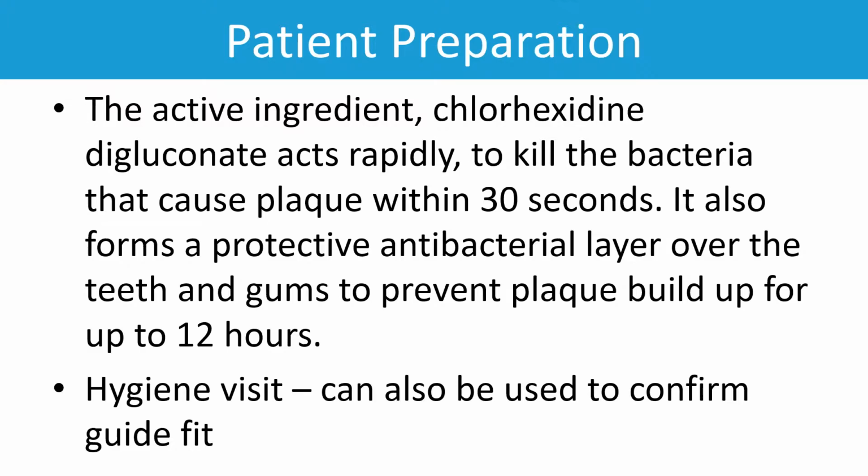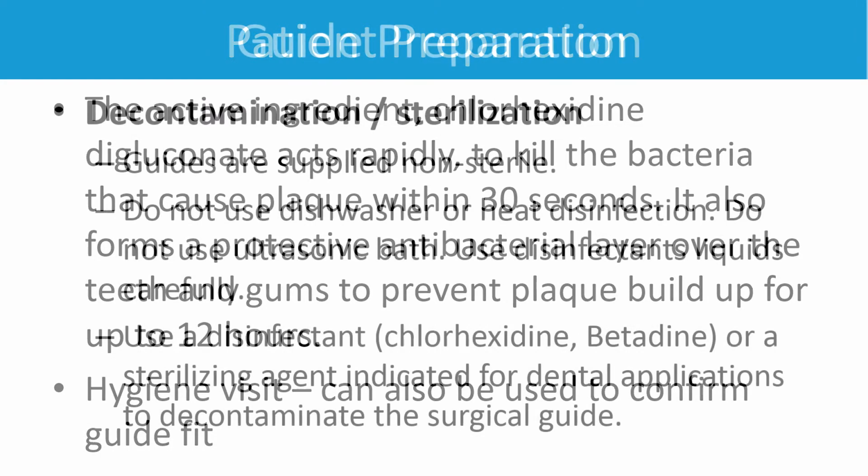And if there's any rock or the template doesn't seem to fit properly, then you must take a new impression and get a new template made. Doesn't mean to say you've got to replan the whole thing again, go back to your CBCT scan. No, the model will just be imported into the software and a new template made for you.